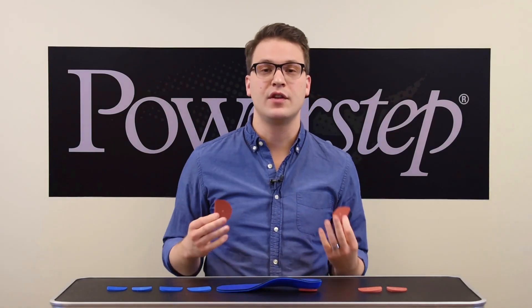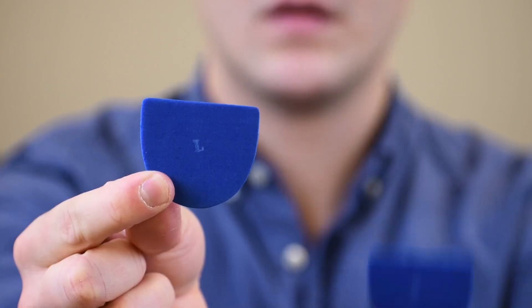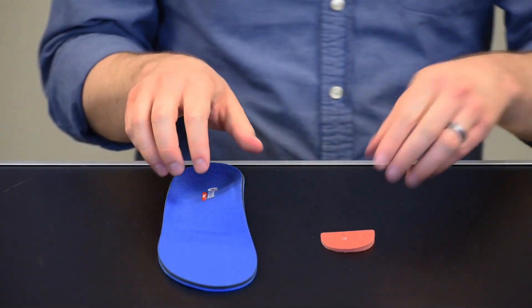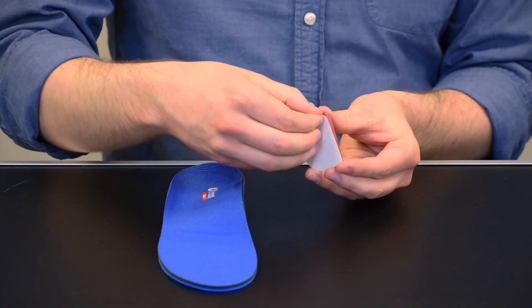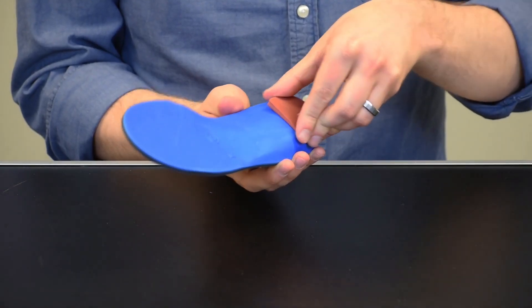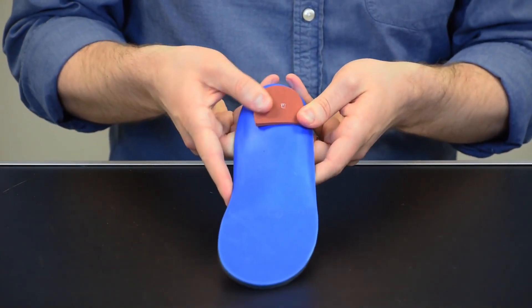These are designated for use as the medial wedge, marked left and right accordingly. To apply, select left or right as designated, remove the adhesive backing from the wedge, and apply firmly to the underside of the orthotic's heel platform. If necessary, adjust the position for comfort.